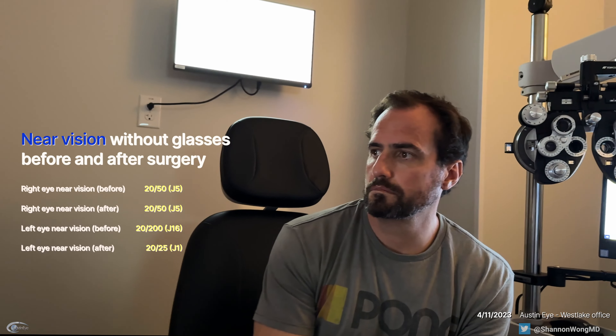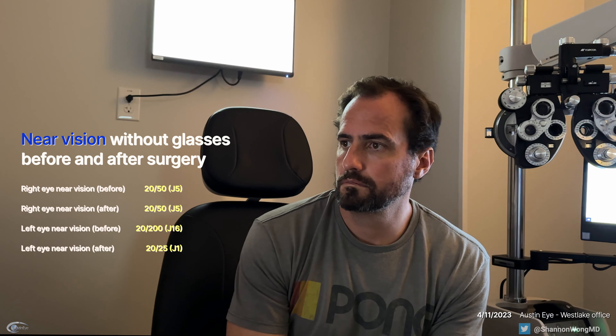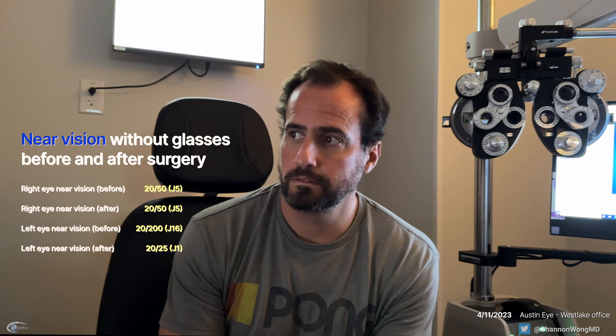So day one, your near vision is J1 to J2, which is like 20/25 to 20/30, near — before surgery you were J16, which is like 20/400. So good. You feel good about it so far? Yeah. I'm very excited about it. Thank you. Very easy experience.